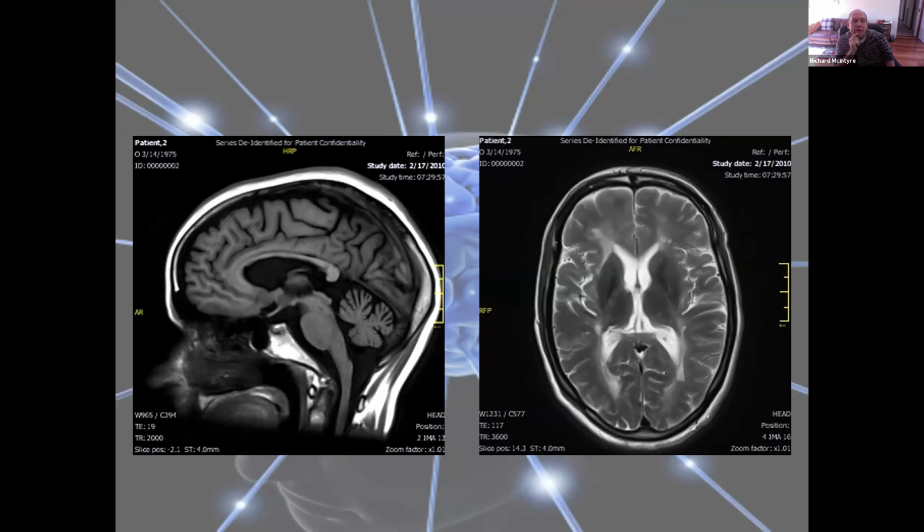So we're looking at our left. Can someone tell me whether that's a T1 or a T2, or what plane is it, first of all? What plane are we looking at on our left? Is it a sagittal, a coronal, or an axial? Is it a sagittal T1? Perfect. Okay, so the plane is sagittal and the weighting is T1. We know it's a T1 because the fluid's dark.